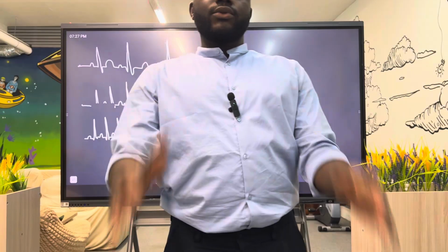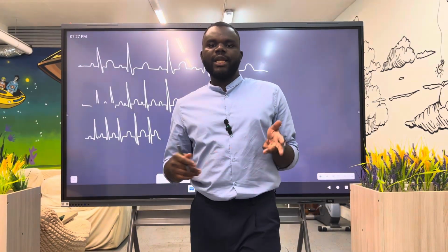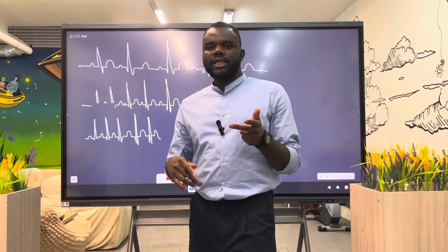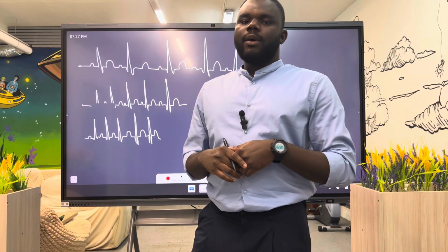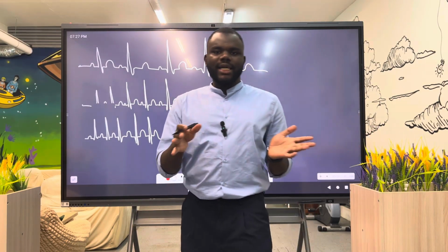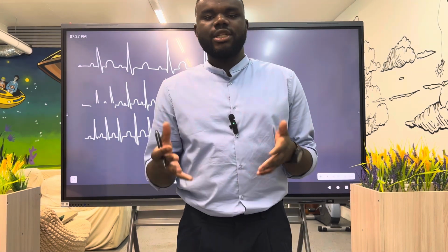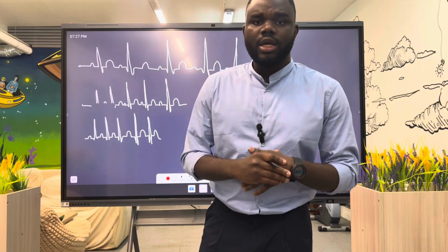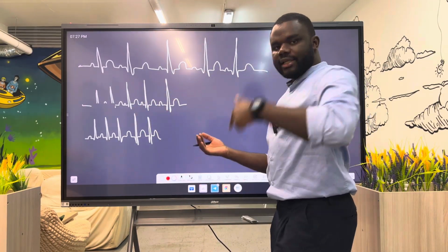Good day, guys. So today we will be discussing SVT, atrial fibrillation, atrial flutter, ventricular tachycardia, and ventricular fibrillation. From our last class, we discussed sinus, non-sinus, how to calculate heart rate, and the basics of an ECG presentation. So what we have today is a recap of what we did the last time.